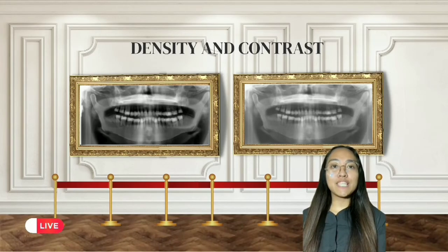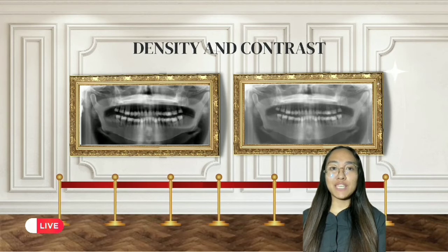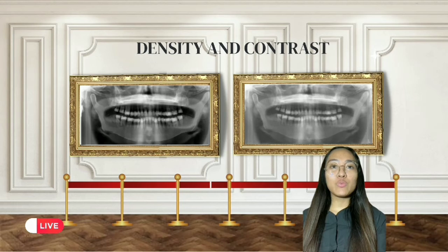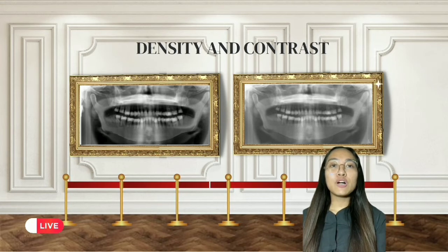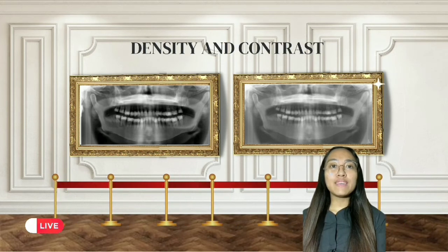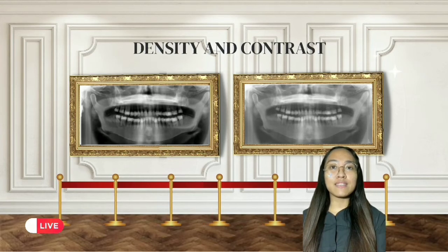On to the next piece, this photograph shows you an overexposed and an underexposed panoramic image. The diagnostic panoramic image results from adequate exposure and exhibits proper density and contrast. Adequate exposure results from choosing the correct kilovoltage and milliamperage settings for the size of the patient. Smaller patients require less exposure, whereas larger patients require more.